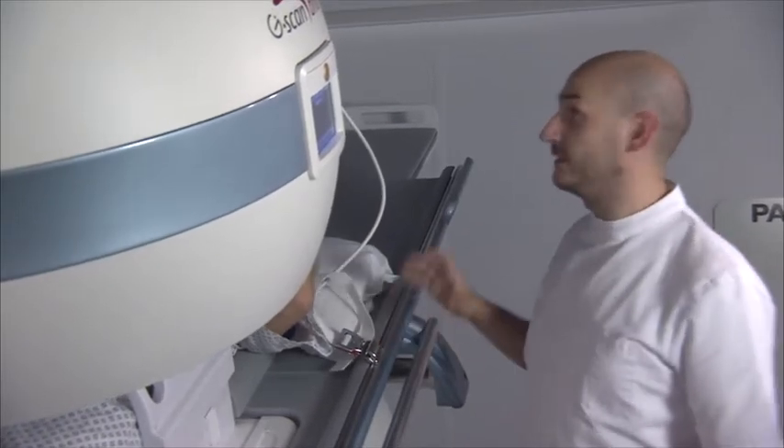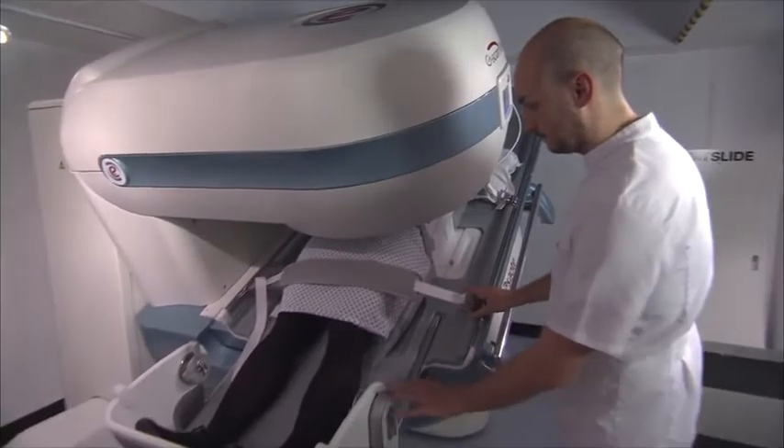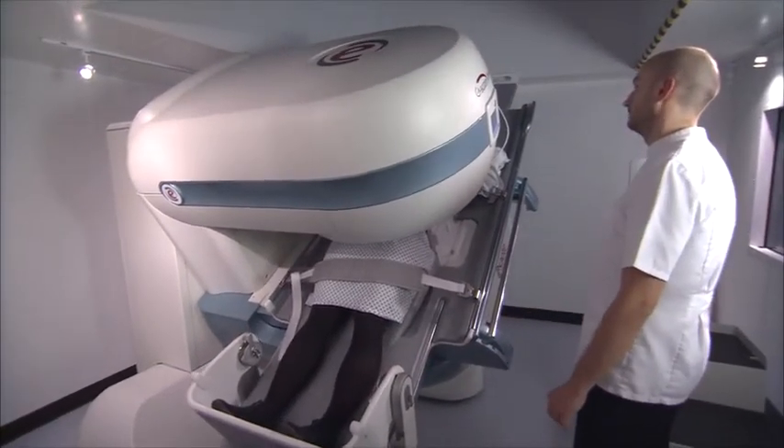Sometimes with claustrophobia, when patients come for the main scanner, you know straight away that they're not going to be able to do it or that they're going to be very nervous. This results in wasted spaces on the scanner, and also a suboptimal examination for the patient — they can tolerate the scan but they've been so nervous that they move during it.